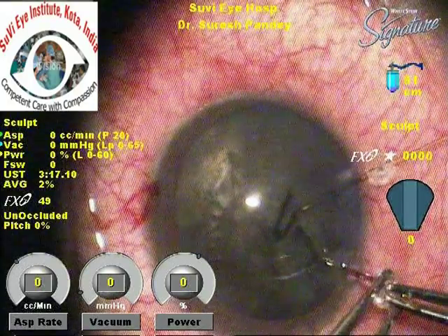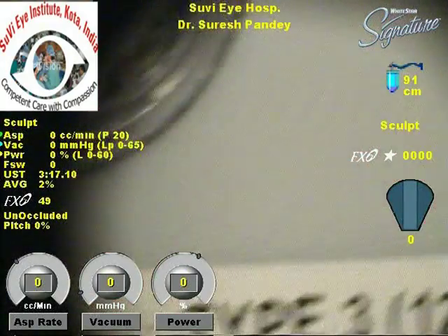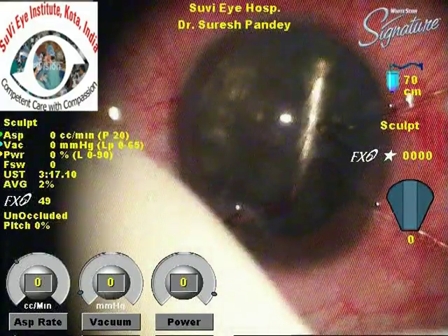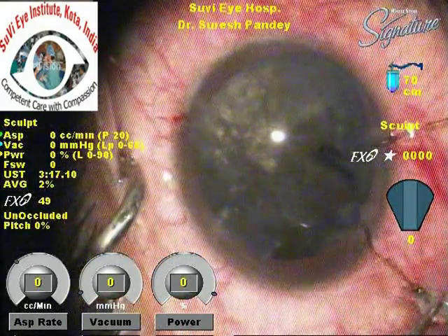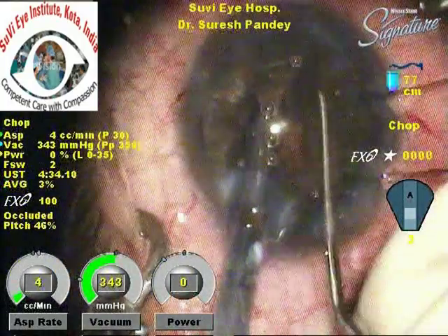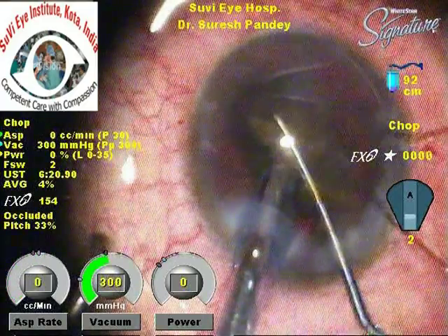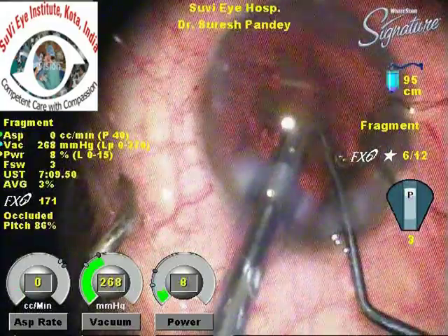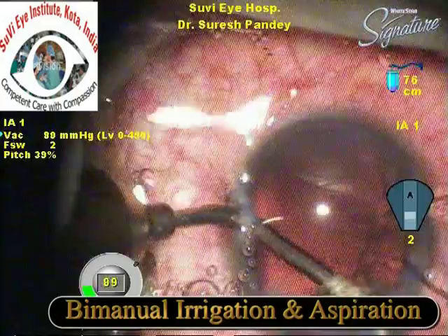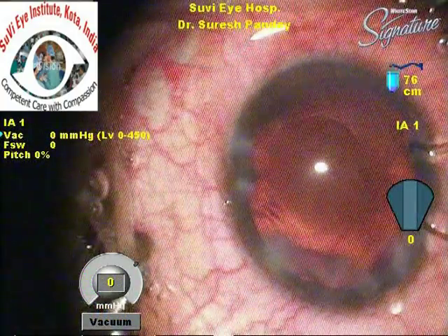After hydrodissection, capsular hooks are placed — again functioning as artificial zonules, pulling the capsule in the area of dehiscence. Two capsular hooks are used here. When tightening the capsular hooks, we must not over-tighten them; the tension should be just enough to stabilize the bag, not to bring the bag exactly to center. We then perform gentle phacoemulsification using a slow-motion phaco technique, ensuring minimal probe movement and good phaco machine parameters for followability. Bi-manual irrigation-aspiration is performed with care for the floppy posterior capsule.